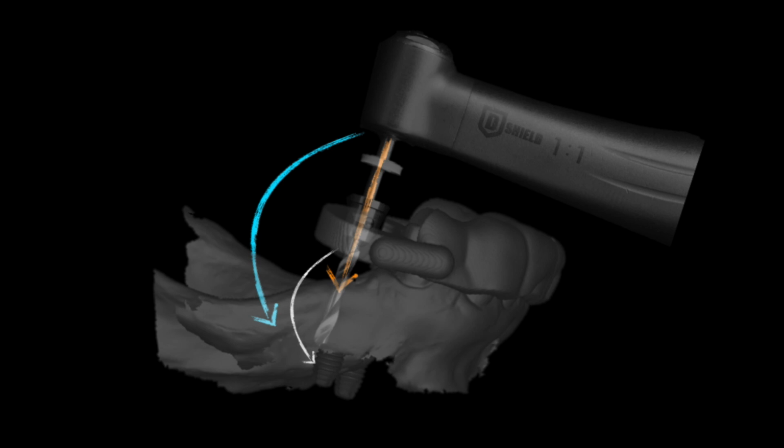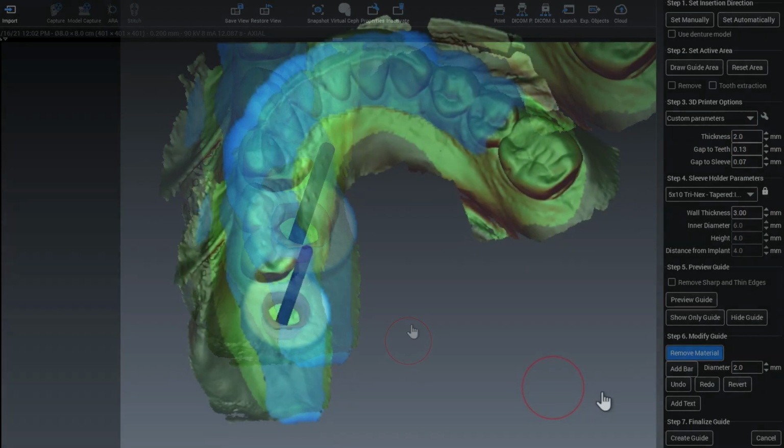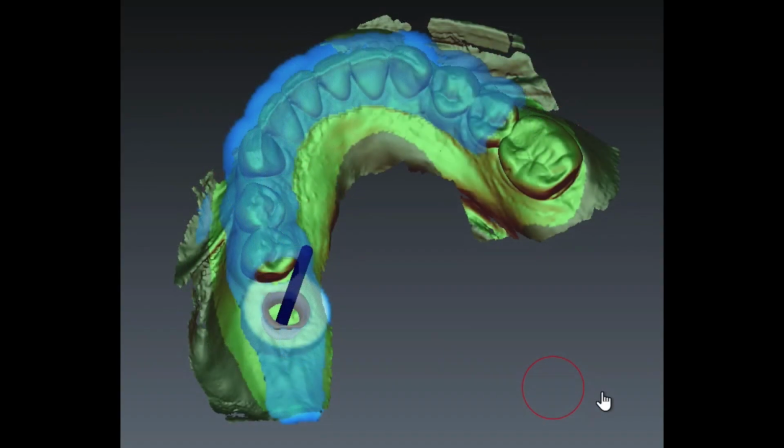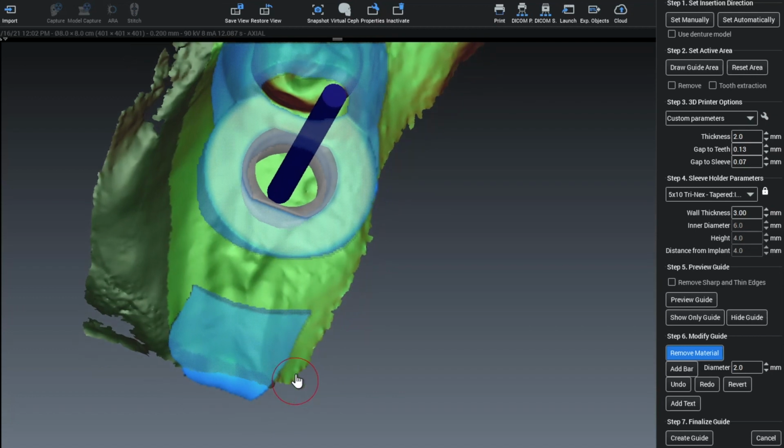So I have this simple trick that I use that will help avoid this in the future for you when you're doing cases like this. So let's take a look at this example case. What you want to do when you're planning your case is to capture enough of the intraoral scan beyond the edentulous space, posterior to that space, so that you can use that area for support for your guide. So here we go. We've extended the intraoral scan and the selected area to be covered by the guide to go well beyond the posterior of the site that we're looking at. In this case, the support's probably not too critical. We have lots of teeth to support the guide, but nonetheless, we're going to plan this method to help reduce any risk of guide movement or unseating.